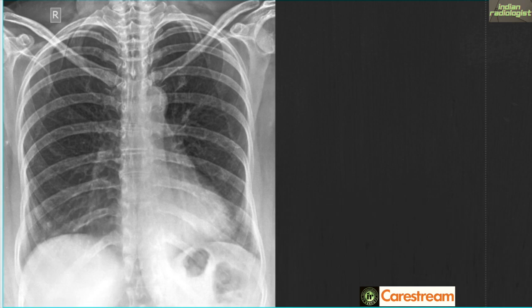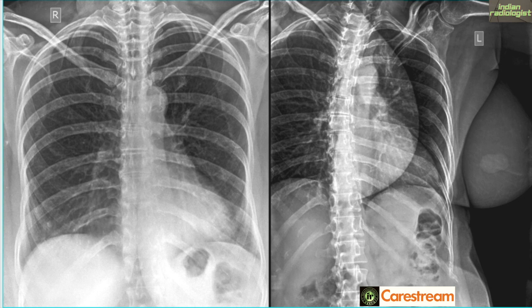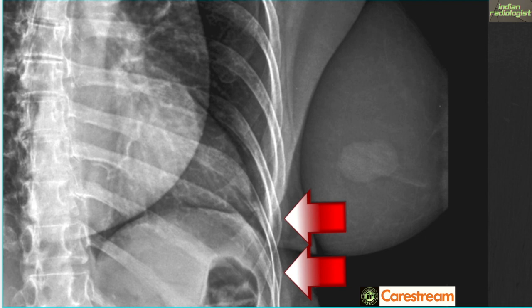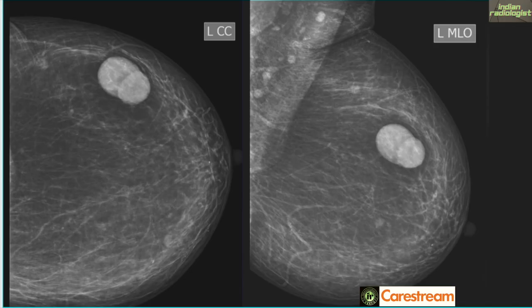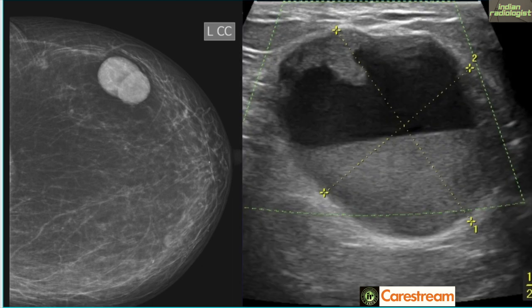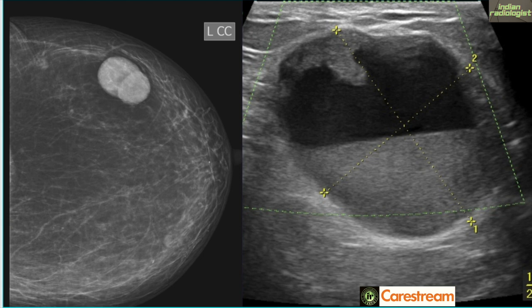The next case is a patient who came for trauma; a PA chest X-ray was requested by the GP but we proceeded with an oblique view. The patient had a couple of subtle rib fractures visible on the oblique. What is also important is that when we look at the breast tissue shadow on the left side, we can see a subtle opacity — an almost biconvex lesion. Mammography and ultrasound were performed; ultrasound demonstrated a smooth lesion with a fluid-fluid level and a small solid nodule. Subsequent histopathology revealed this to be a neoplastic lesion.